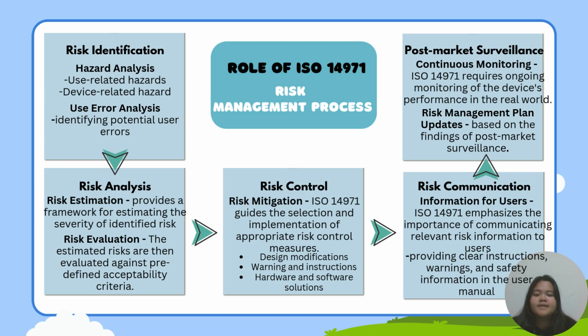And the last one is risk management plan update. The risk management plan must be adapted based on the findings of post-market surveillance. This may involve implementing new risk control measures or revising existing ones.